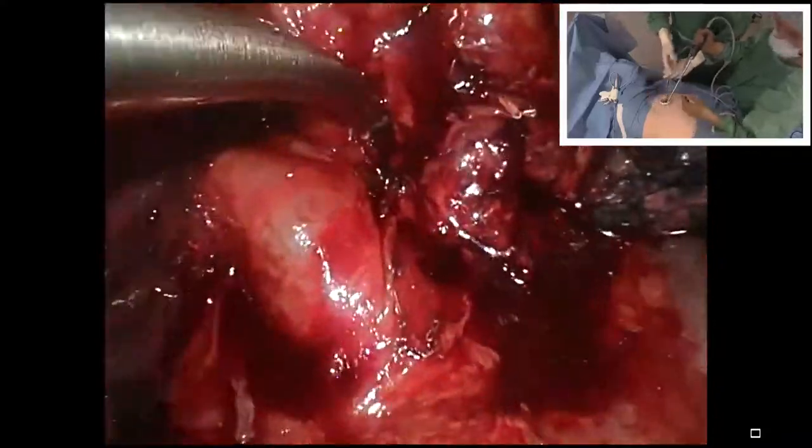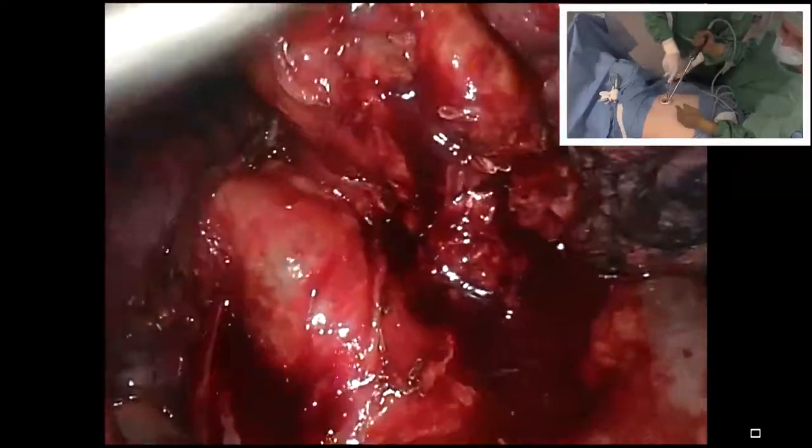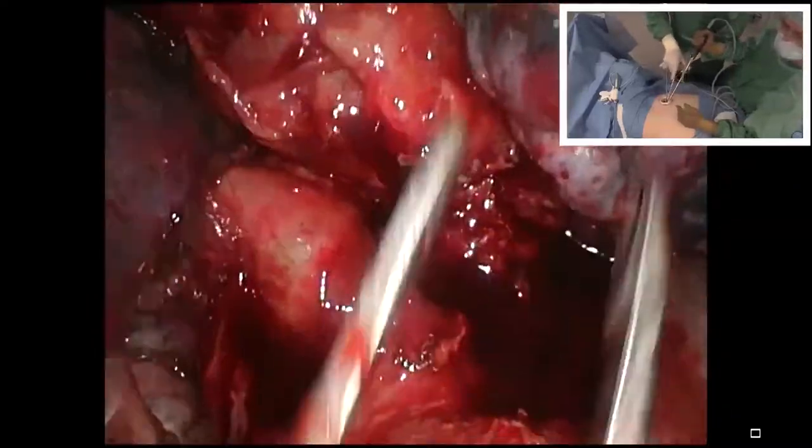In a normal lobectomy, I will use a clip. But in this case, no. Clear. Okay, go now, posterior.